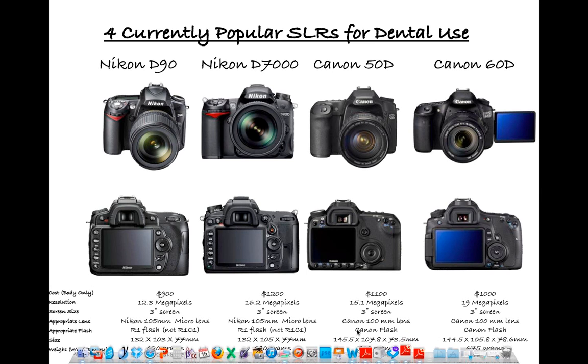As Lance Armstrong said, and I know it may not be fashionable to invoke the name of Lance Armstrong right about now, he says it's not about the bike. Well, it's not about the camera. I've taken gorgeous pictures with my iPhone. I wouldn't use them to present the case, but when somebody says, well, my camera really gives me a hard time and that's why I don't get good images, that's not the reason. It's not knowing how to use mirrors and retractors and not how to handle lighting. And those are the things we'll talk about next.